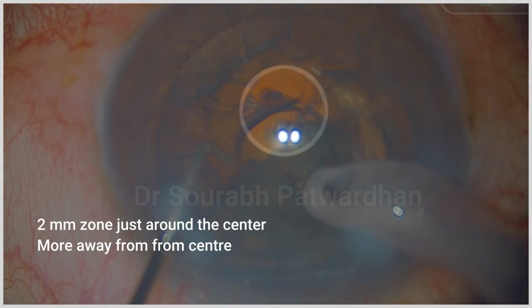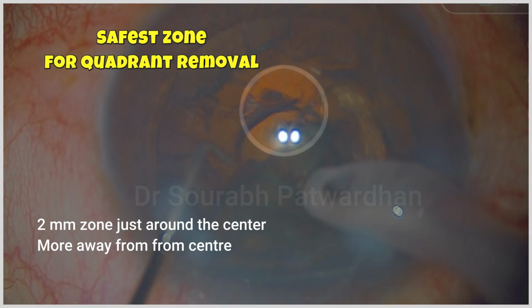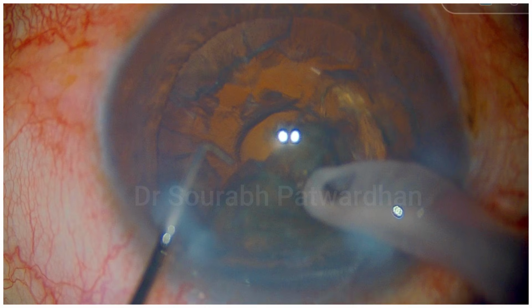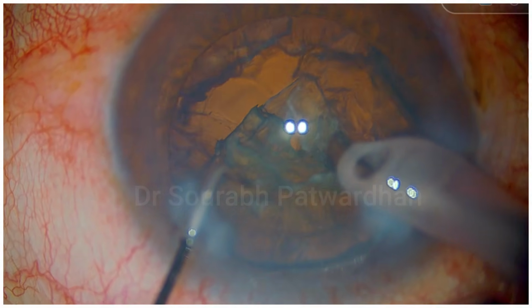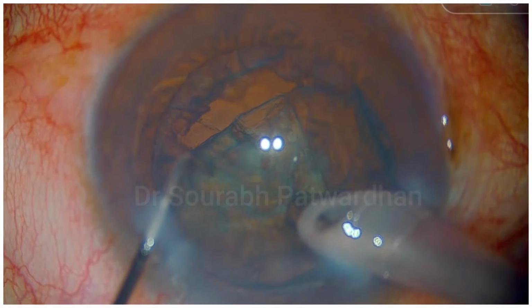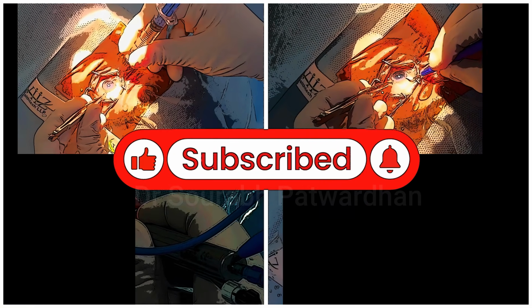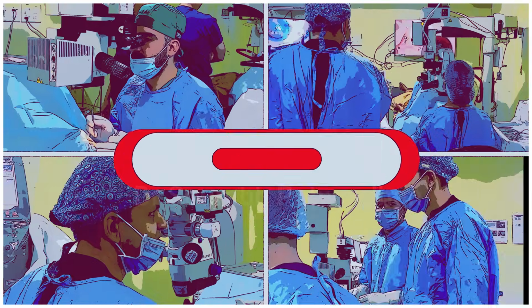So I feel that we must understand that the safe zone of phacoemulsification is just a 2 mm zone around the center and a little bit away from the center. So you should avoid the subincisional area for doing quadrant removal. It's not really safe, as you can punch through, like you have seen here.